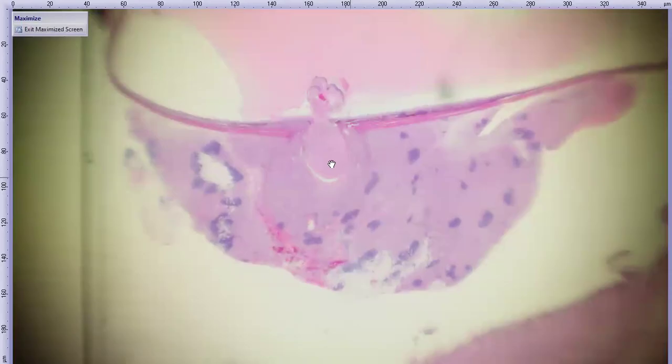This is the retina. We'll go closer to see that, but it is detached. It's kind of plastered against the posterior lens capsule. And then as we go all the way back, in the orbital adipose here, peripapillary connective tissue, maybe sneaking into the sclera and choroid, there is this cellular infiltrate.